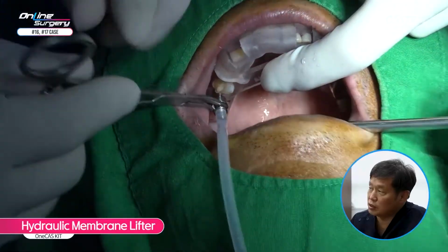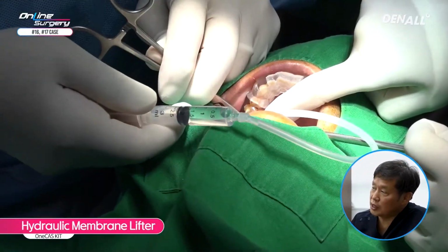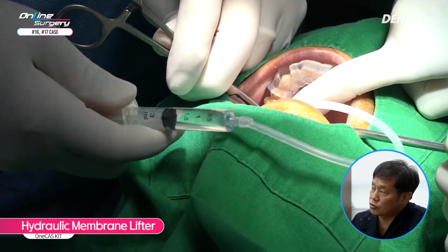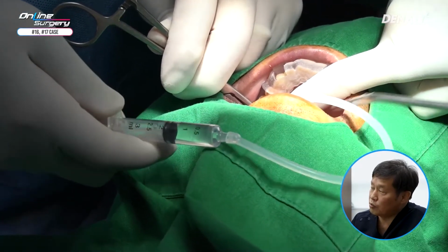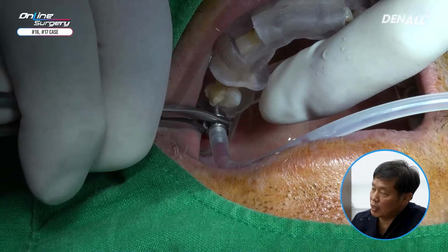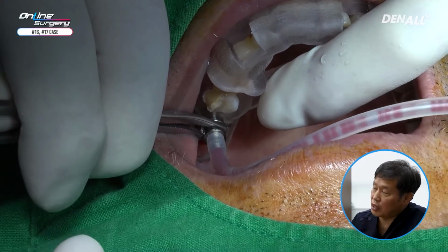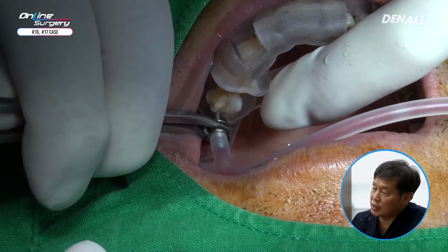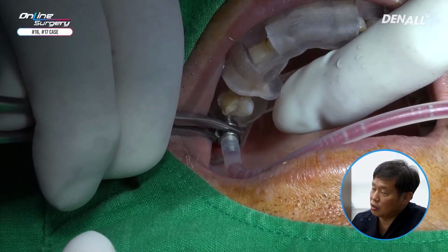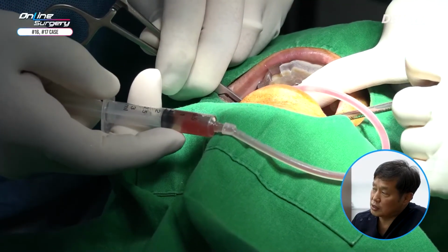Hydrolift is done with the template. A 3 cc syringe is used to advance at 0.5, and then aspiration is done with repetition. You can see that we're going in. Upon aspiration, blood regurgitation is observed. There's very little air, so there is a negative pressure. Sinus membrane. This means the sinus membrane has been lifted without puncture.